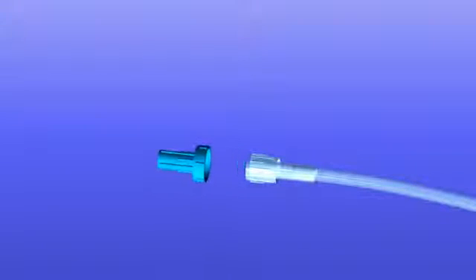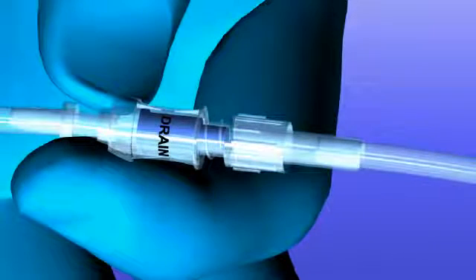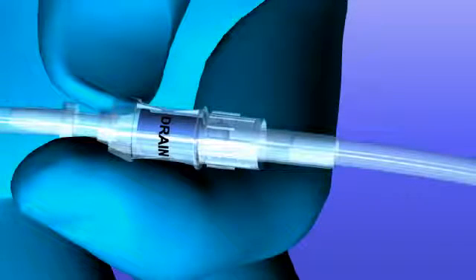Remove the protective cap from the connector on the drain line and align it in the center of the silicone valve surface. Push the connector into the silicone valve and twist firmly to connect. The connection must be tight to allow the flow of fluid.